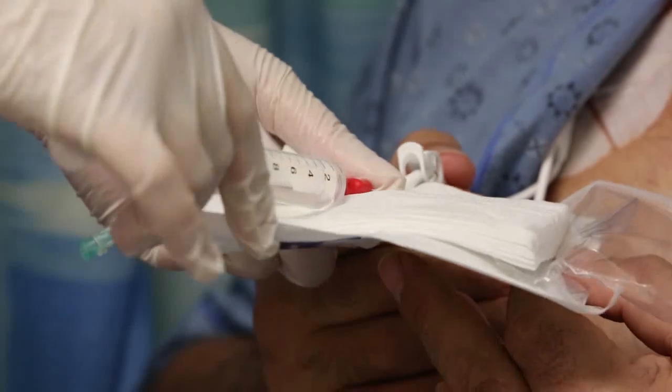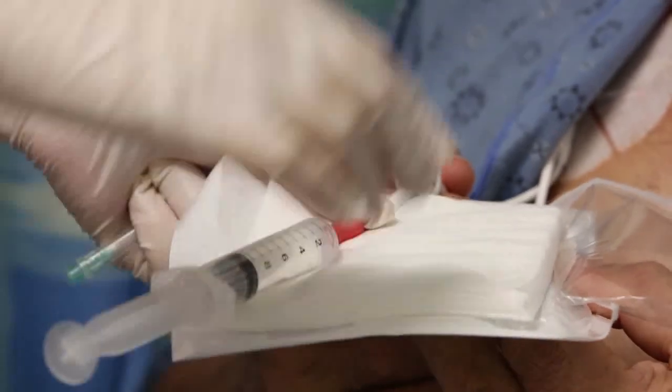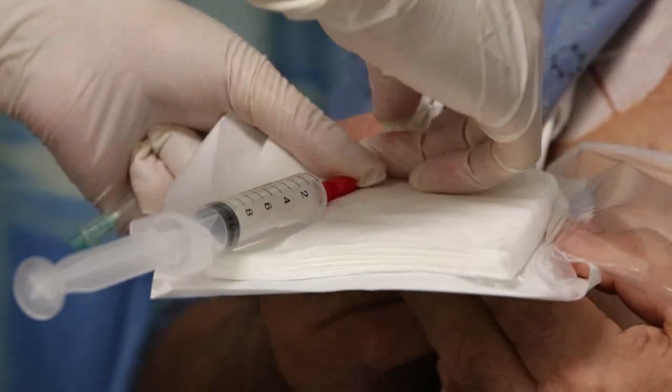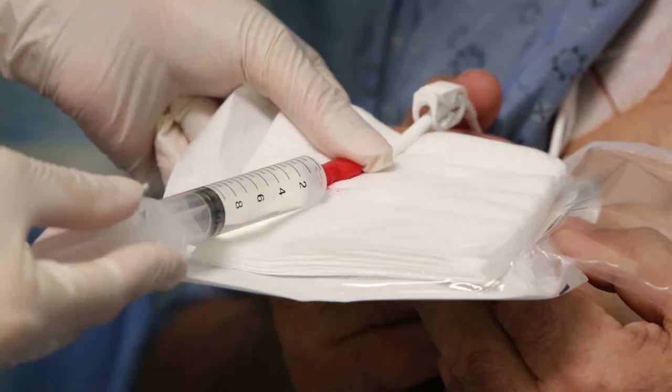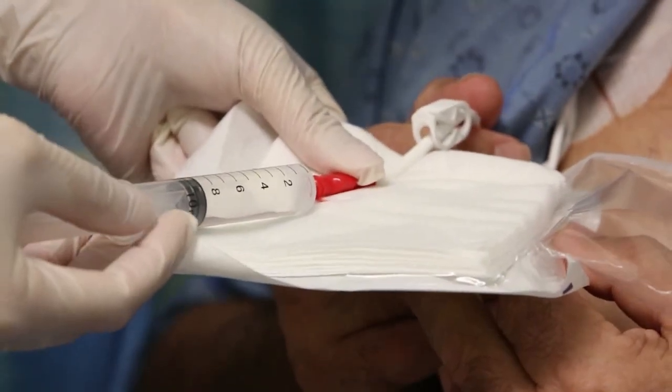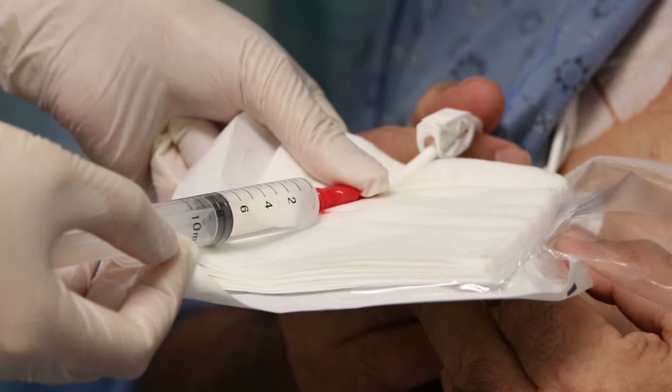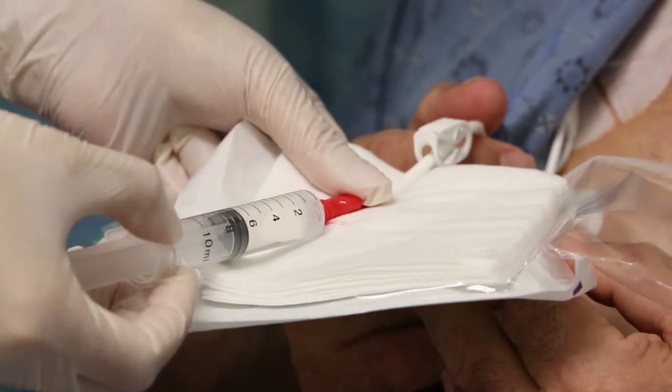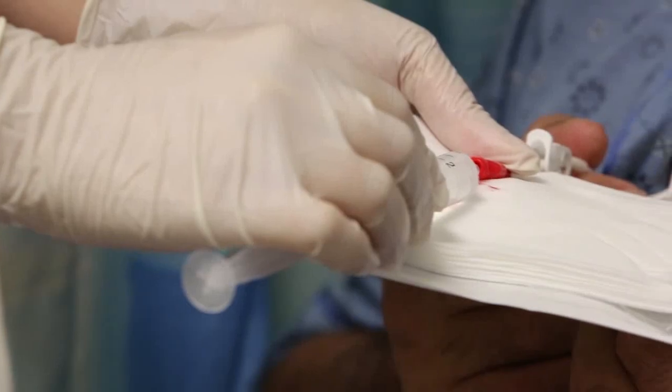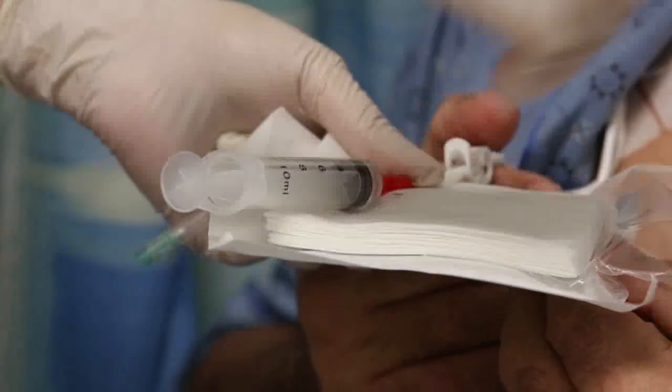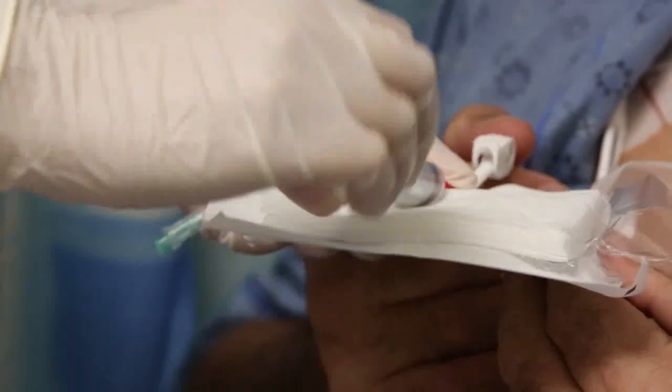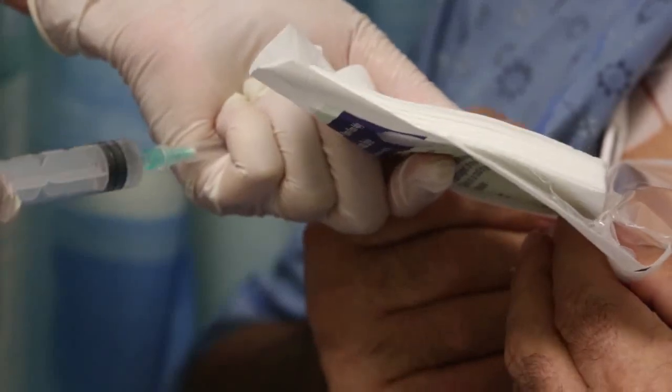Central lines are to be flushed with a total of 20ml of saline after blood withdrawal to ensure line patency. Unclamp the line and flush the first 10ml of saline using a push-pause method throughout the flushing process. Repeat this procedure with the other 10ml of saline and clamp the line whilst pushing the last few mls of saline to create positive pressure inside the line.